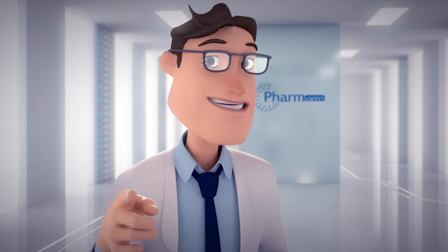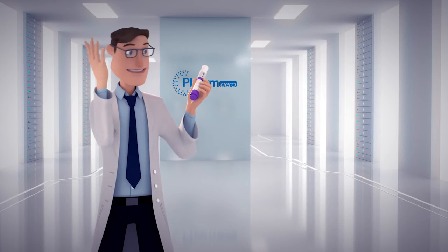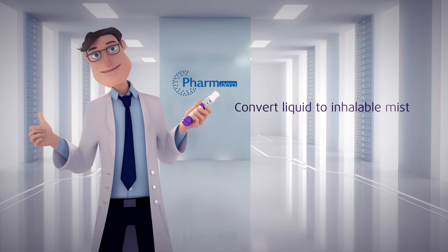Take this opportunity to differentiate your products. You could even brand the ADI to make sure people recognize it. With the ADI, you can convert liquid to an inhalable mist.